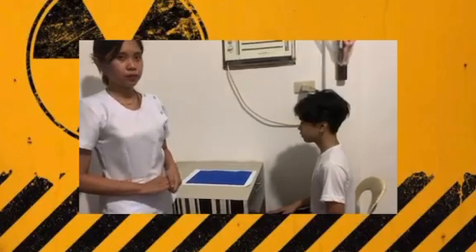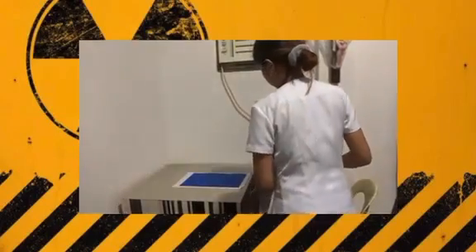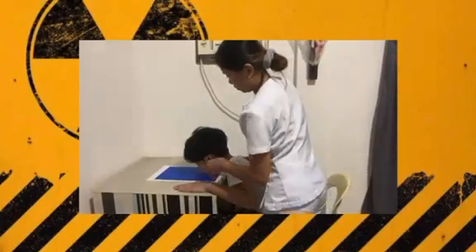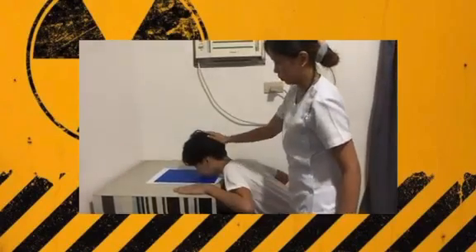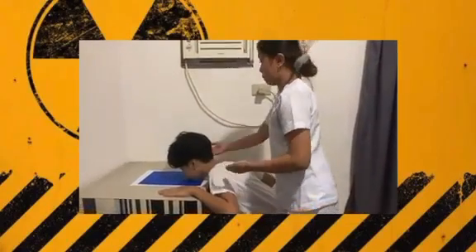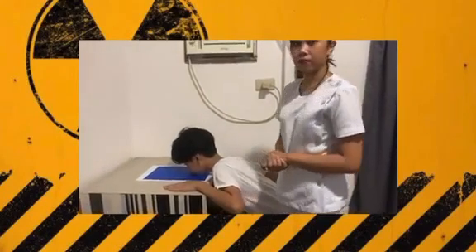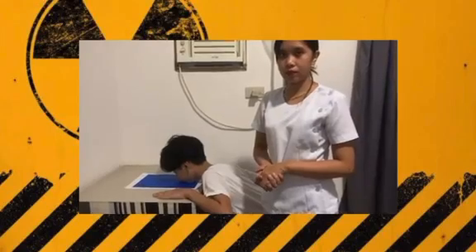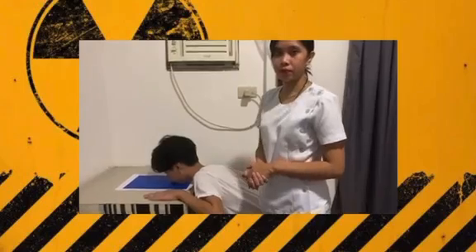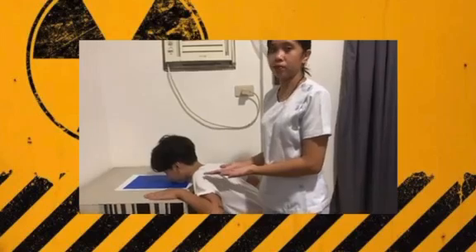In table radiography, position the MSP perpendicular to the midline of the grid or the table or Bucky surface, preventing rotation or tilting of the head. One way to check for rotation is to palpate the mastoid process of each side and lateral orbital margins with the thumb and fingertips to ensure that these lines are equidistant from the tabletop. So, this is the facial bone Waters method, parieto-acanthial projection.